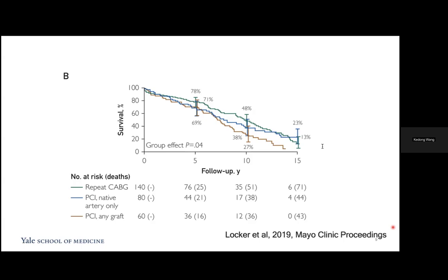It's a retrospective study. It's a small trial. It's not randomized. But it's, in a sense, more contemporary than the AWESOME trial because most of the time second generation drug-eluting stents and distal embolic protection devices were used, whereas in the AWESOME trial, those technologies were still being adopted at that time or they hadn't come out.